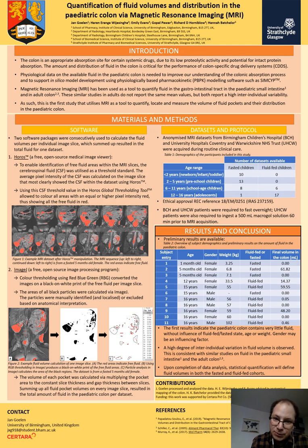We used HOROS to color the free fluid in the datasets. For this, we selected MRI slices that most clearly showed the cerebrospinal fluid in the spinal canal, of which we calculated the average pixel intensity or pixel brightness. Then we used this CSF value in a thresholding tool, which colored all pixels with the same or higher pixel intensity as this threshold value in a red shade. It's important to note that the lower the value used for thresholding, the more pixels will be picked up and the more red areas we obtain. However, the overall contrast within the dataset does not influence this, as the average pixel brightness of the CSF will also be lower in low contrast datasets.